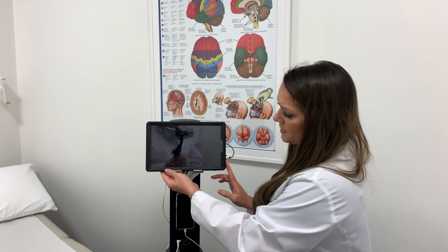The benefits of telehealth are numerous, but just to list a few: our goal is to reduce hospitalizations, improve clinical outcomes, minimize patient transport to the hospital, and of course lower cost for the patient.